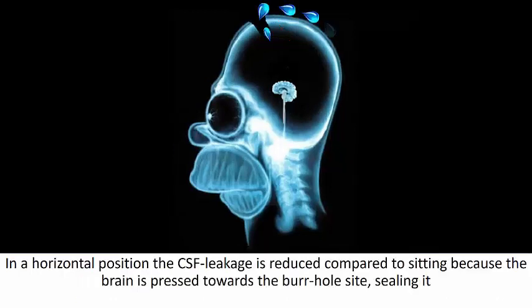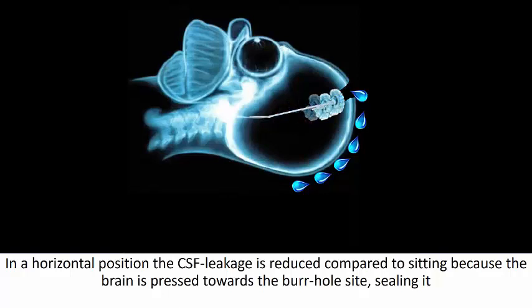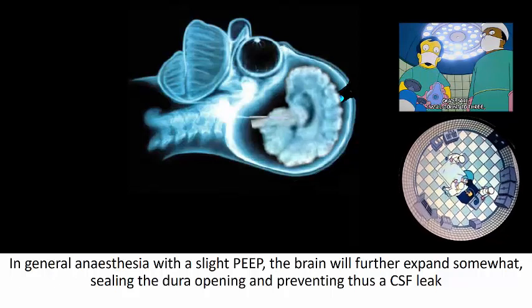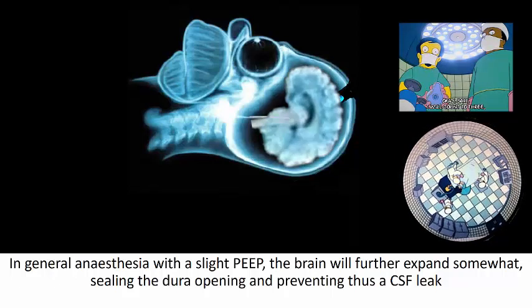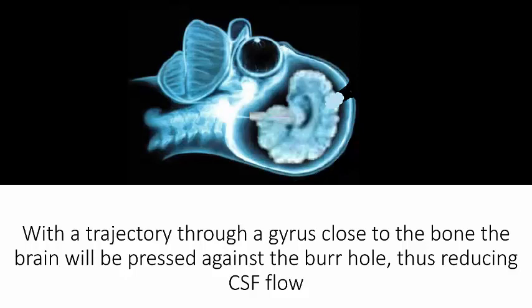The reason why I used to implant the electrodes in a semi-sitting position was that I wanted to avoid CSF leakage. Paradoxically, when I started to implant the patients in a horizontal position, the CSF leakage was much reduced, since the brain is pressed towards the burr hole site, thus effectively sealing it. And in general anesthesia, with a slight positive pressure, the brain will further expand somewhat, contributing to this effect. And of course, for this to happen, it's important that we choose a trajectory through a gyrus close to the bone, so the brain will be pressed against the burr hole.